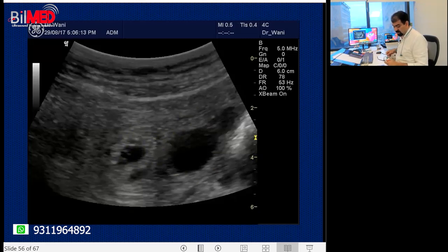Dr. MS: ectopic with corpus luteum. Yes, very good. This is what we discussed. If I am seeing two cystic lesions on the same side, one has to be the corpus luteum. It is this follicle which has ruptured and now is the corpus luteum, and this is the adnexa in which I am having the gestational sac.